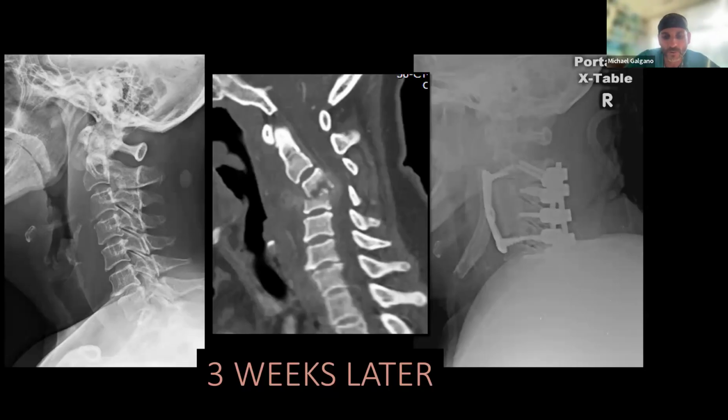I remember a few years ago in New York, we had a case like that. A patient had a CTA, they had a history of seizures, some weird neurological presentation, and on the CTA, you could pick up that we suspected there was a big abscess. He had had some esophageal injury several weeks earlier. So things were adding up that this may be an epidural abscess before we were able to get the MRI.